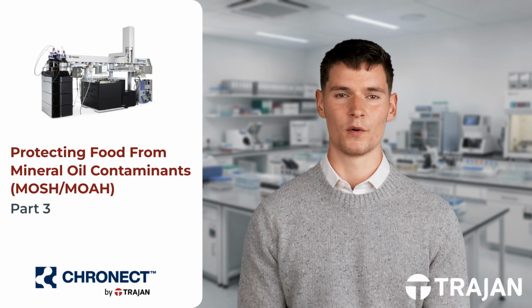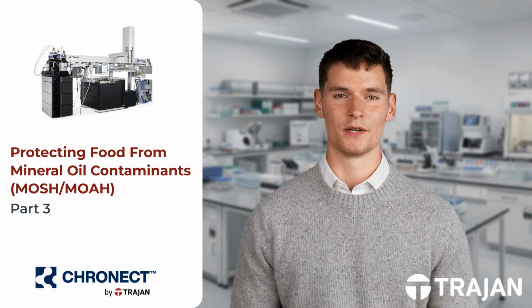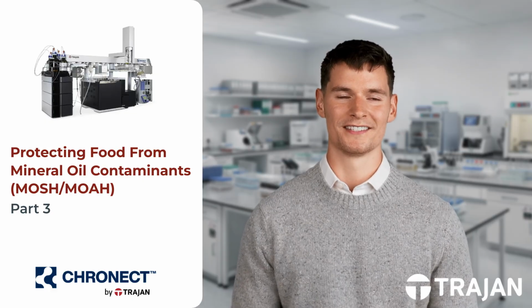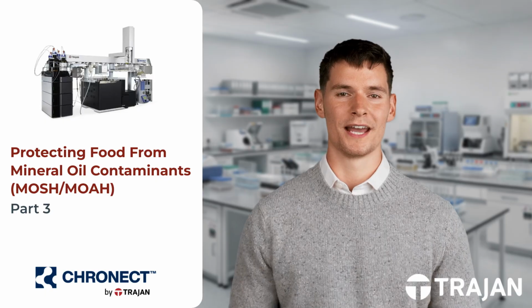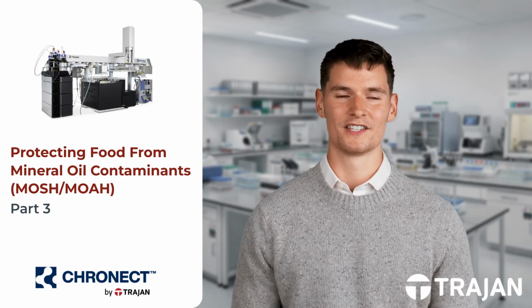Welcome to the final installment of our series on mineral oil contamination in food. In the previous videos, we discussed the importance of MOSH and MOAH and highlighted the challenges of detecting them. Today, we'll take you step by step through the laboratory process, from handling complex food samples to obtaining measurable MOSH-MOAH results, and show how automation transforms each stage.